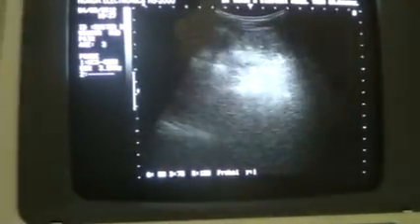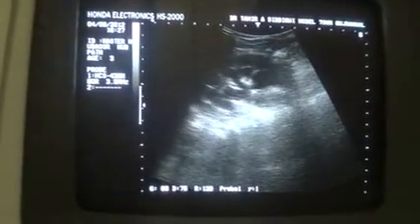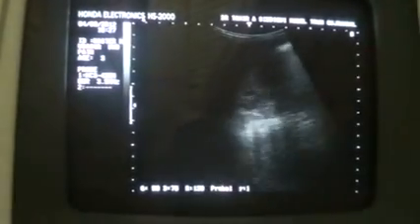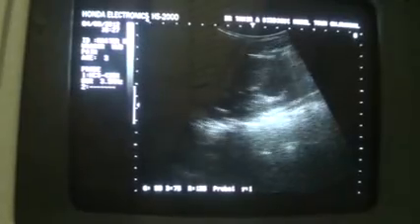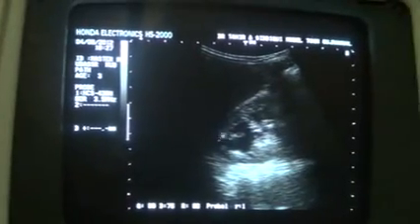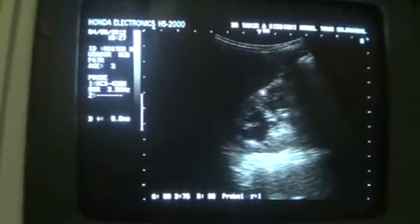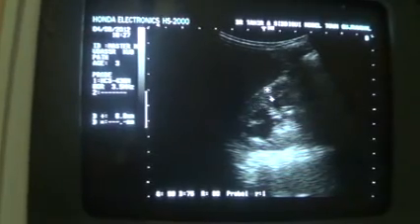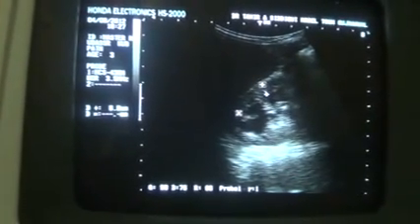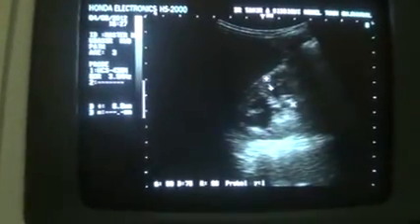Now let's go to the left kidney. This is the upper pole, and the mid-region. Parenchymal thickness is normal. Parenchymal echogenicity is raised and corticomedullary differentiation is seen. You can see this is a medulla — this is the pyramid. And these are the dilated calyces. There is a small tiny echogenicity within the hydronephrotic fluid.